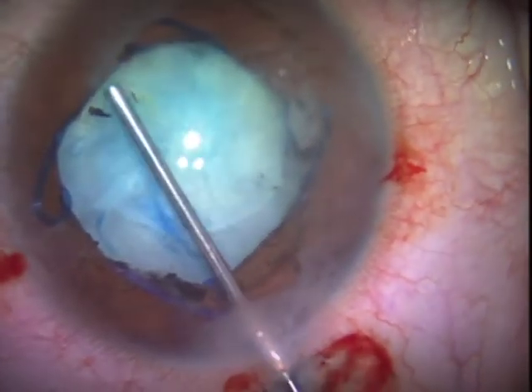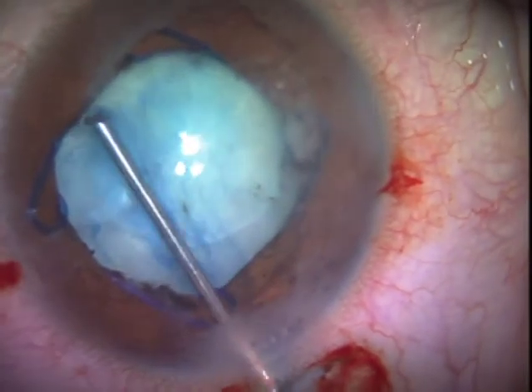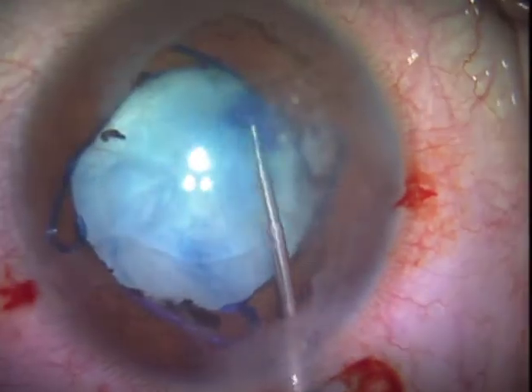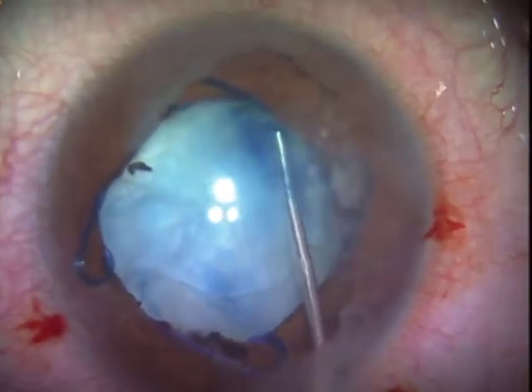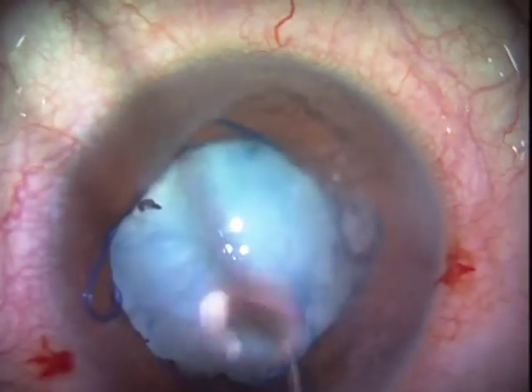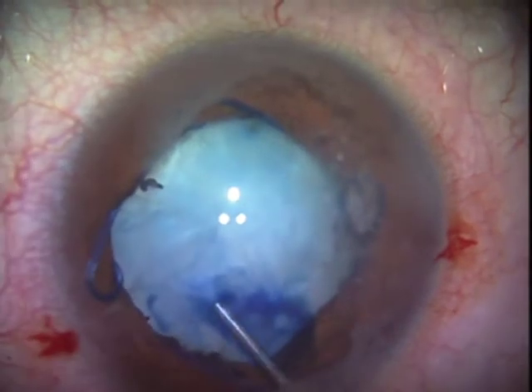I was trying to aspirate a little cortex there, but I decided to put on more viscoelastic. You can see it being painted under the cohesive viscoelastic. It just doesn't want to stain very well.